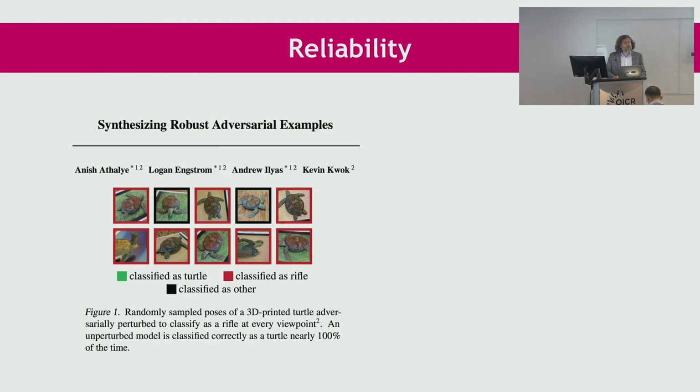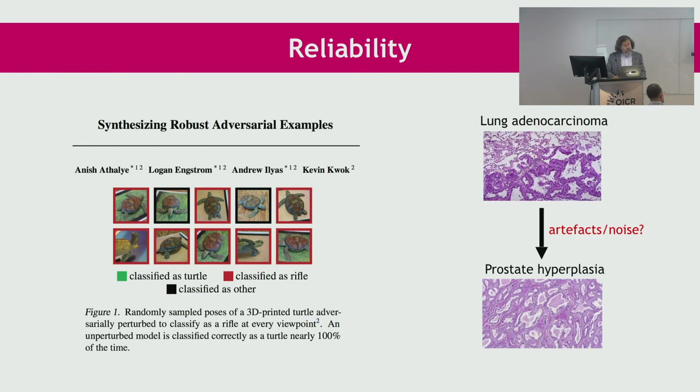Okay. Don't we have site information when the pathologist is receiving the digital images? Because this case, it's lung versus prostate. We definitely do, but if we give full control to AI and AI can make some mistakes and it is not supervised, then things can go wrong. And this is something that, even if we ignore it, regulatory bodies will look into. So we have additional information.